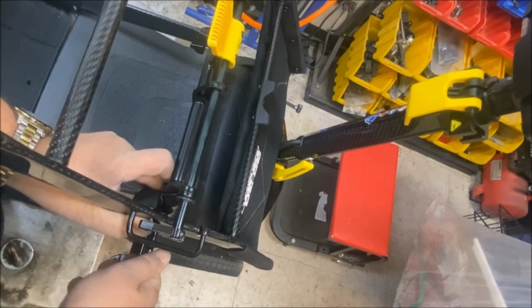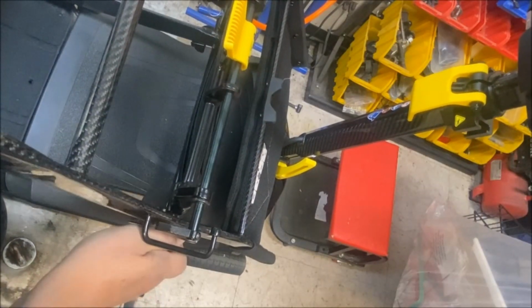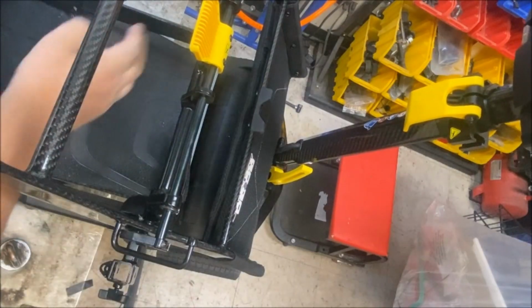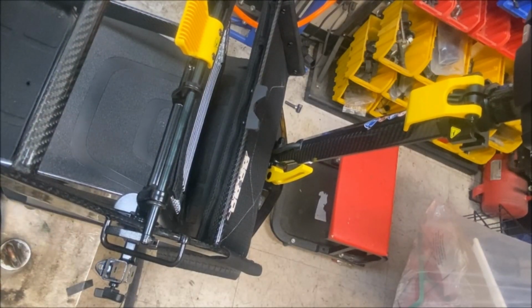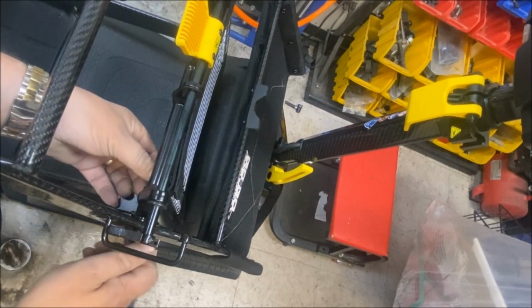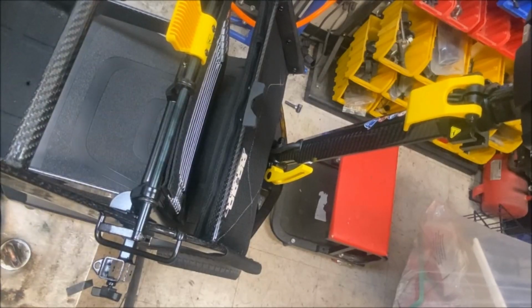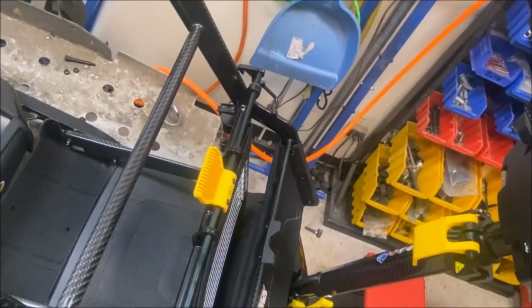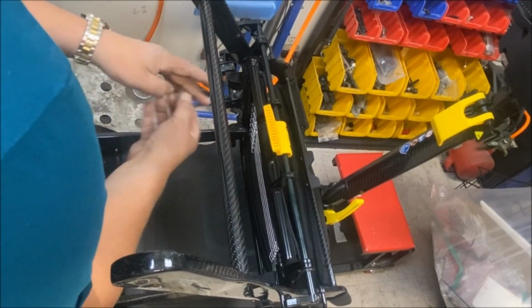Thread your bolt through, making sure your inserts are in there. Just get it kind of lined up and work on the other side. Okay, come on. Okay, that's in. And then you just need your locking washer and your acorn nut. Same on the other side. You can't see much on this side. Locking washer and the acorn nut.